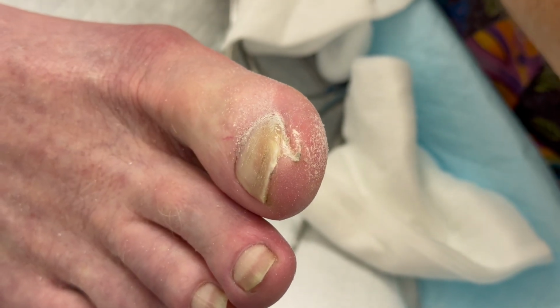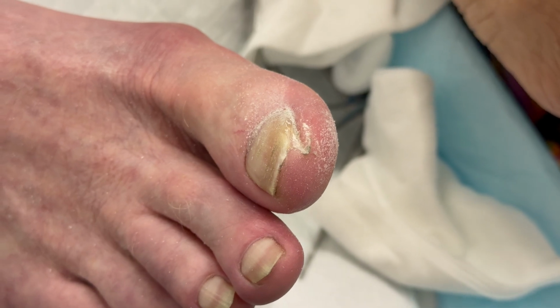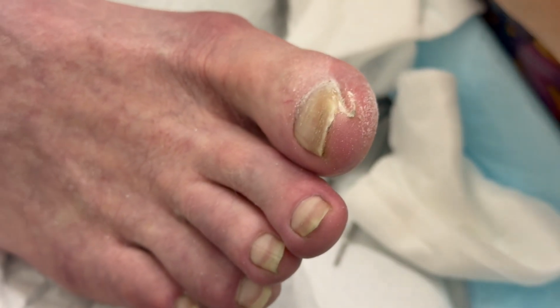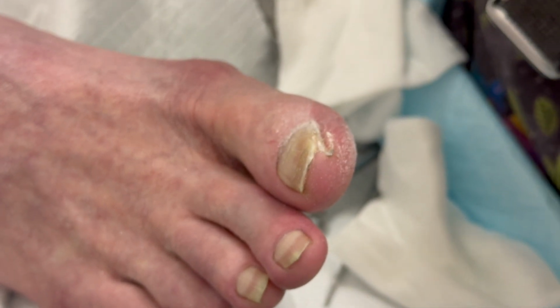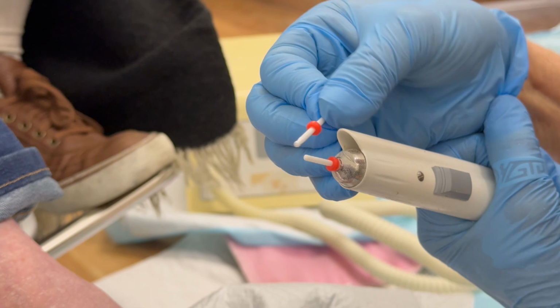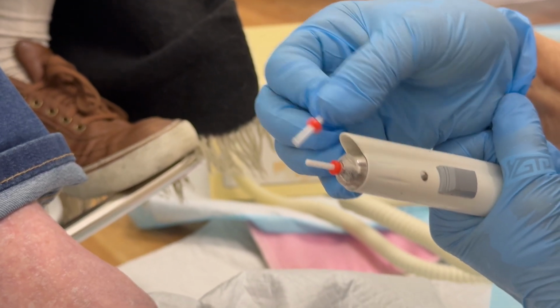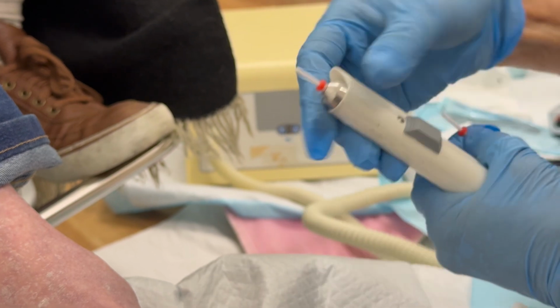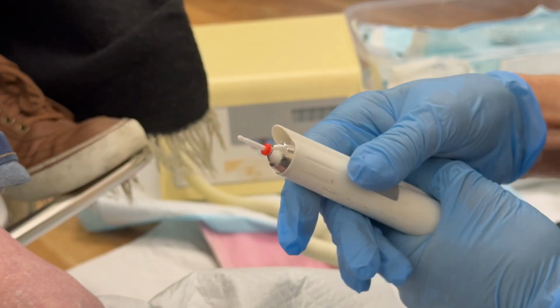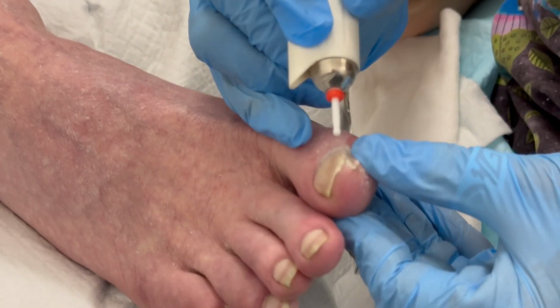Actually, I might have a thinner one. Yes. I'm going to just pour these out here, and then I'll sterilize these all later. Okay, aha. So this has a little round edge. See, the tip of this one is different, even though there's a dark spot on it. It is sterile. It just came out of the package. So I'm going to trade this one out. Put this one in, and put that on, and see.